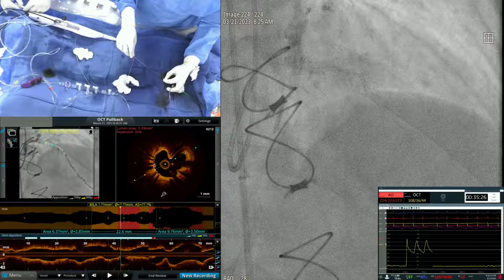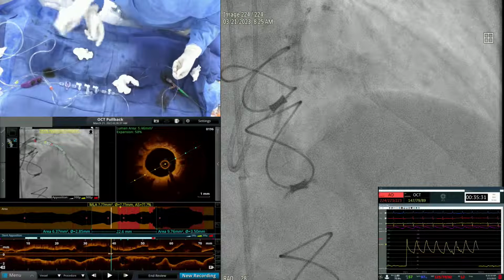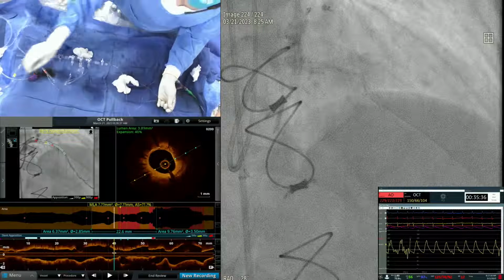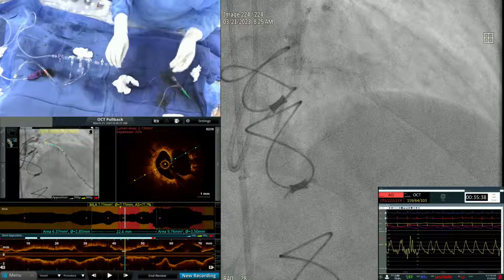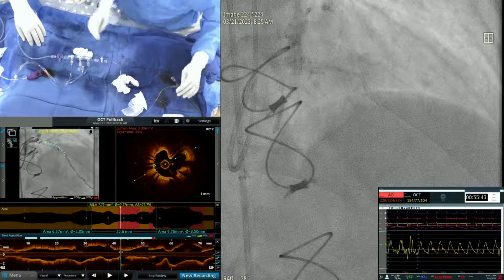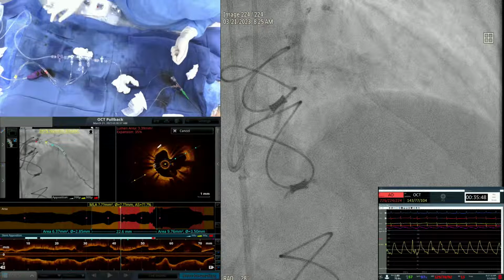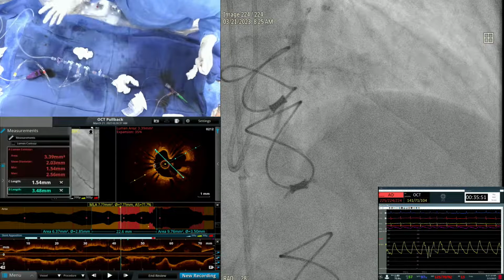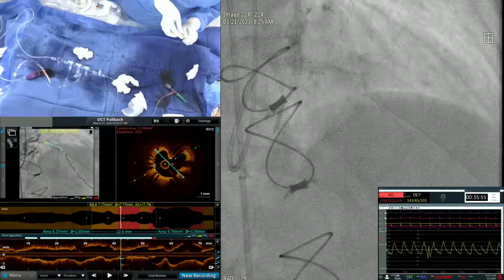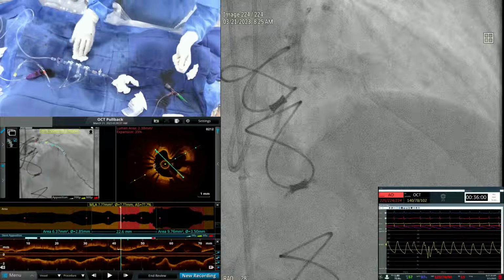So basically that's where the issue may come down to the plaque burden. But with stent expansion, underexpanded stent will be very clear, that your minimum stent area is 4.5 or 5 or 4. A lot of people say your minimum stent area should be more than 80% of the reference vessel, distally and proximally. Many times we know that the stent distally may be 4.5, proximally 5.5. So it has to be more than 80% of the proximal or distal minimum stent area. So that is the expansion.